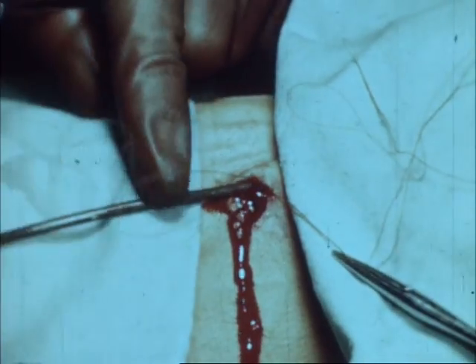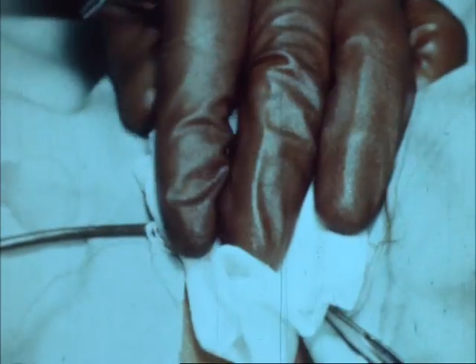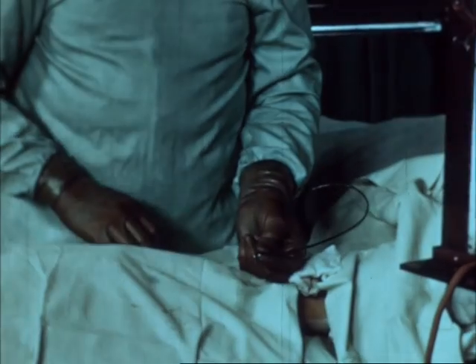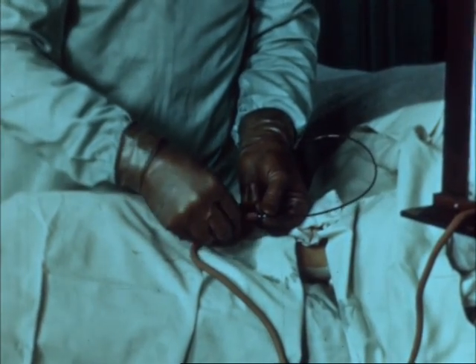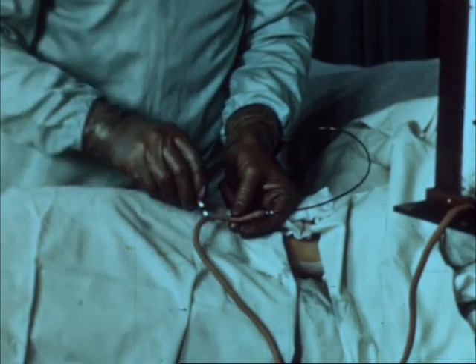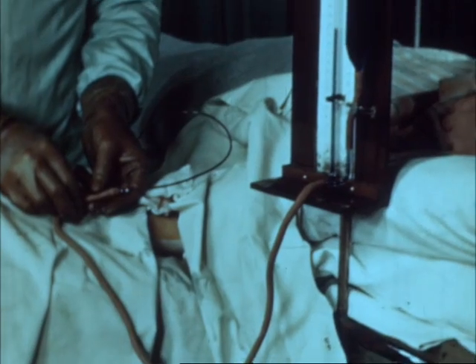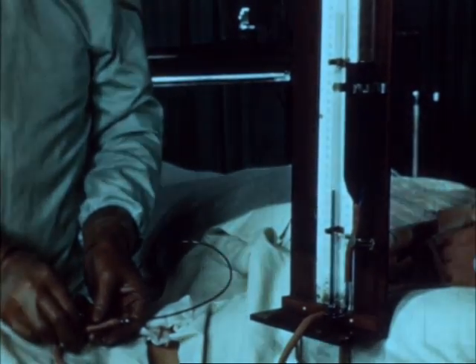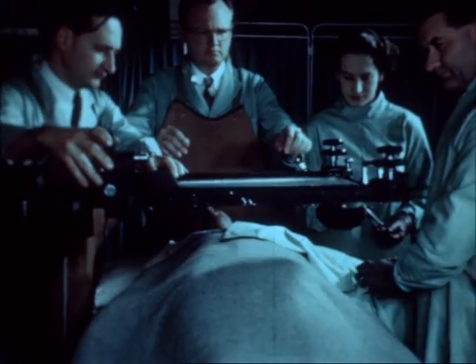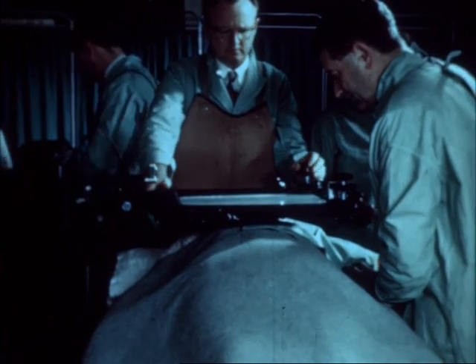Once the catheter has entered the vein, the wound is covered by sterile swabs, and the catheter passed gently along until about 20 centimeters have entered the vein. A saline manometer may now be connected to the catheter and a slow drip of heparinized saline maintained. For demonstration purposes, the saline is stained with Evans blue dye. Further manipulation of the catheter into the desired position is controlled by the X-ray screen.